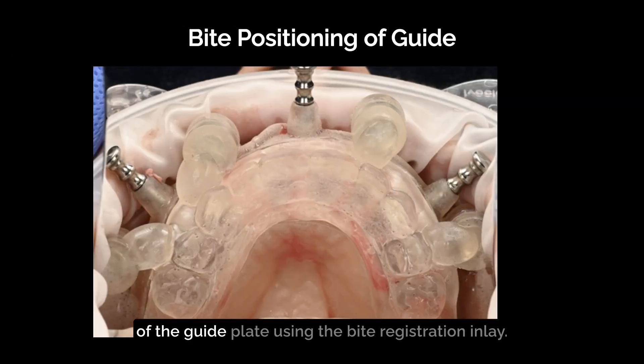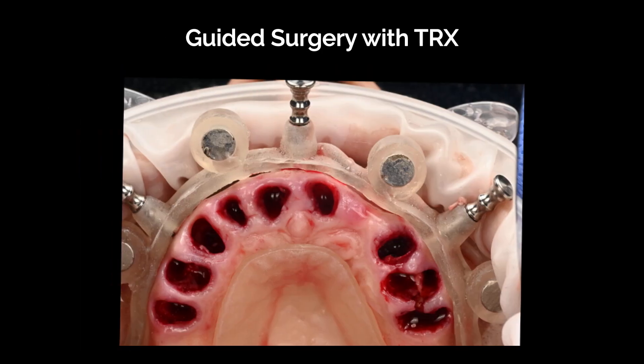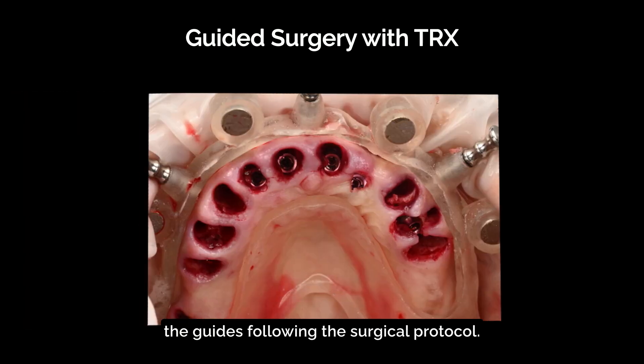This is followed by the precise positioning and fixation of the guide plate using the bite registration inlay. After replacing the bite registration inlay with the guided inlay, implants are placed through the guides following the surgical protocol.